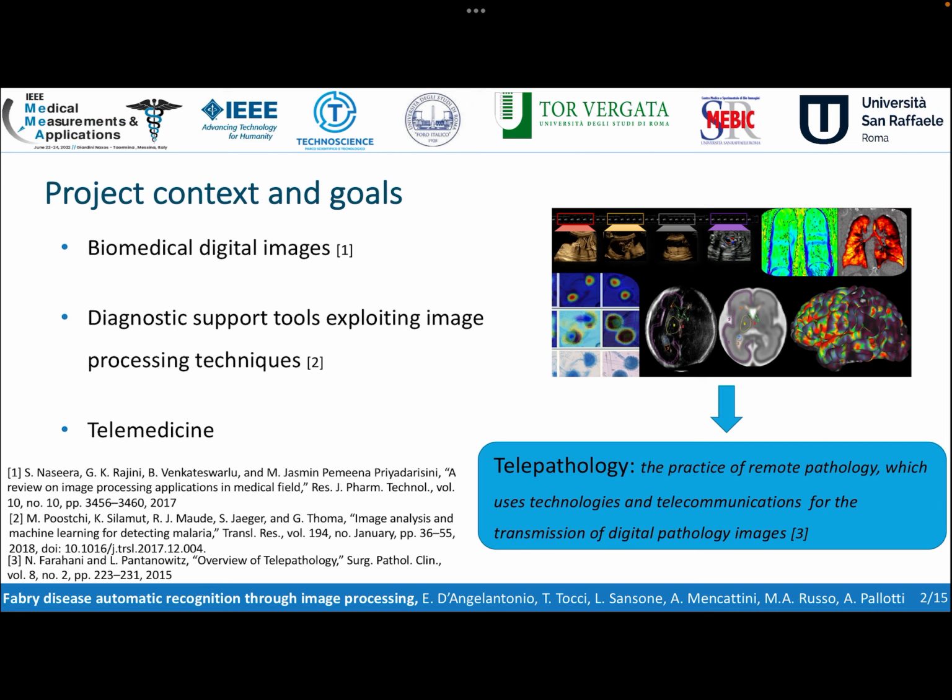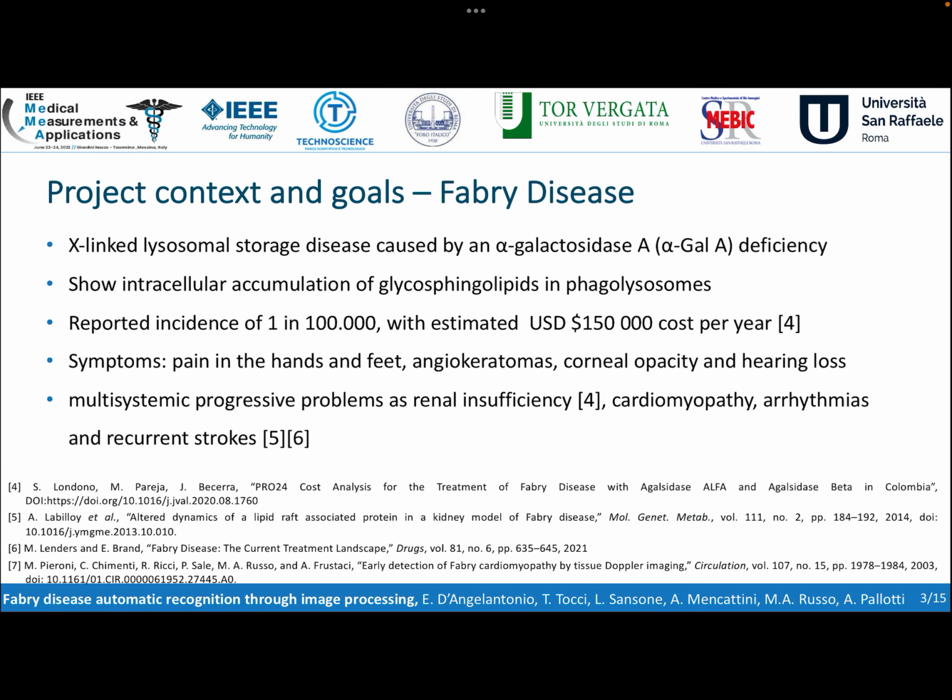So the context in which the work develops is the context of telemedicine, and in particular of the telepathology. Telepathology is a branch of telemedicine, and this is defined as the practice of remote pathology, which uses technologies and telecommunications for the transmission of digital images.